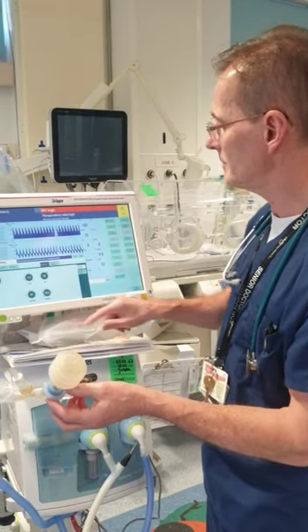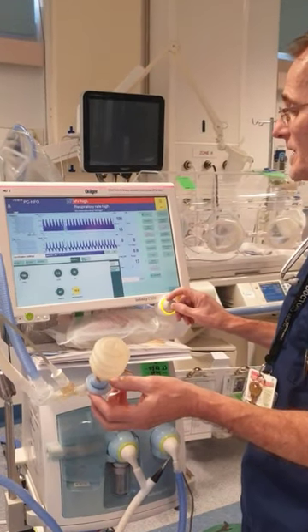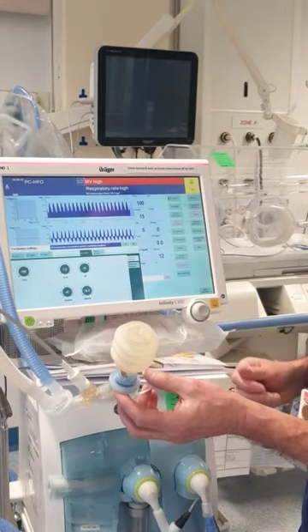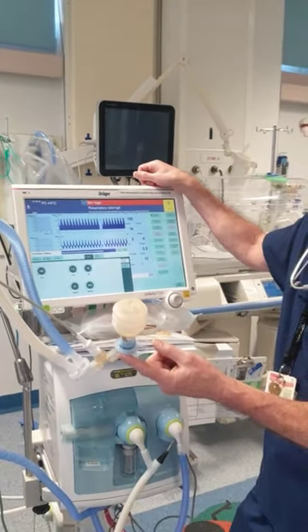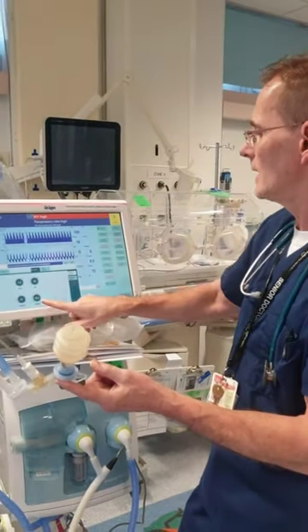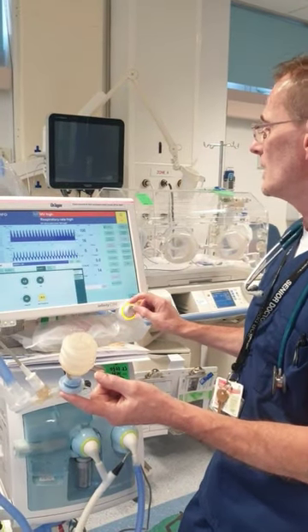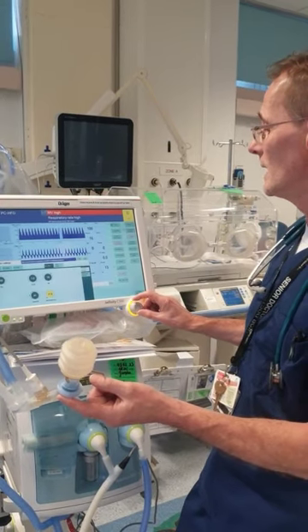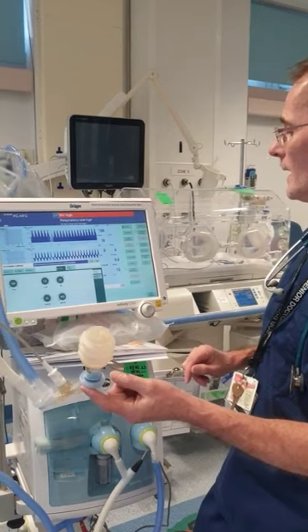So I've pressed the mean airway pressure, and I'll turn up by a centimeter, acknowledge that, and I wait for a few minutes watching the screen of the baby to see has the saturation improved. And if it hasn't improved, that tells me those lungs aren't adequately inflated. So I'll press and increase it again by another centimeter. Now, if you have to go above 16 centimeters, you have to acknowledge that before we can do that in the machine. So I'll acknowledge that, and up I go.